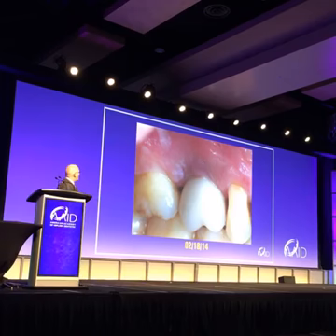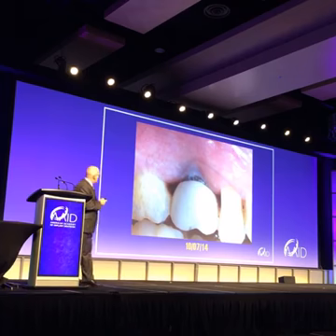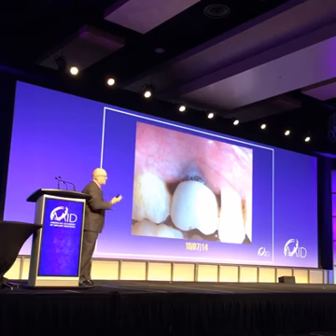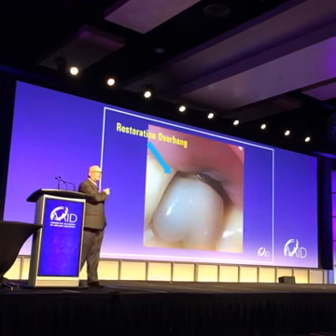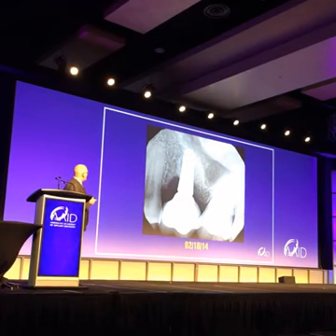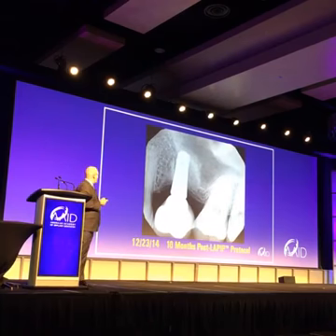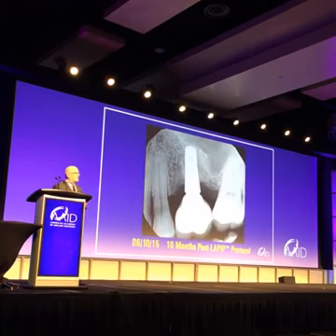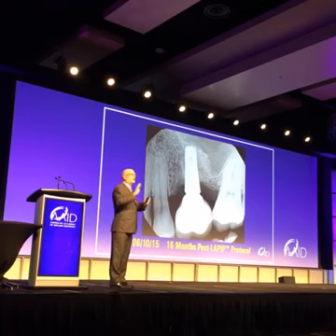Another case, you can see the infection around the implant, around the crown. Here it is, I think about a little less than a year later, but you can see he lost some aesthetics. Well, there's no aesthetics really on the posterior, but when you see why, it's because the lab put an overhang on there. So now at least he can maintain that. But look at the bone loss. There, 7.5 months later, 10 months later, 16 months later, that bone is still there. One treatment, less than an hour, I'm done.